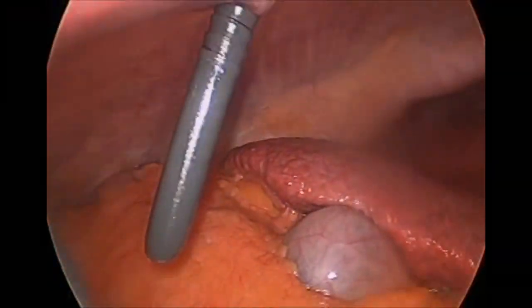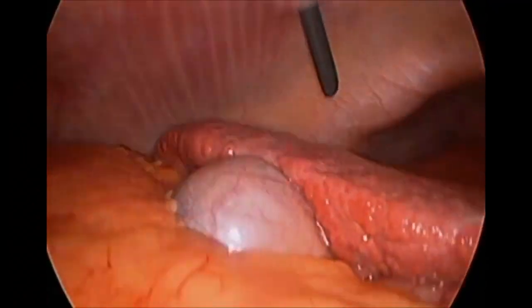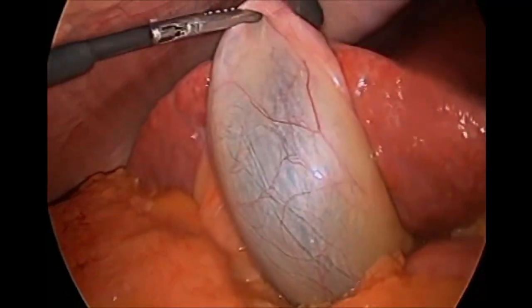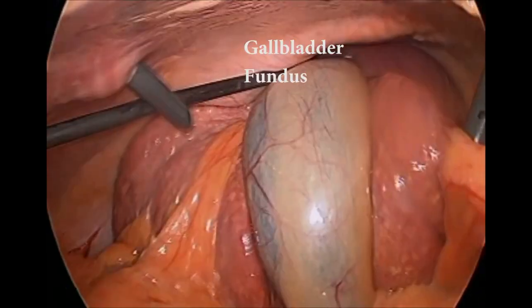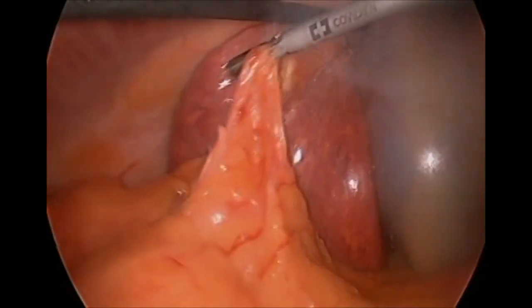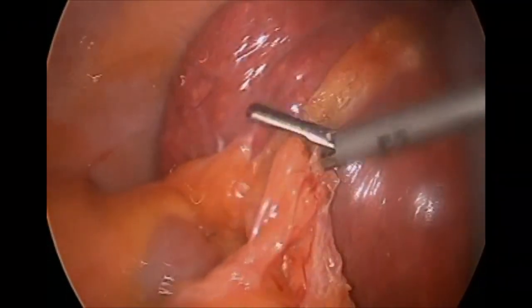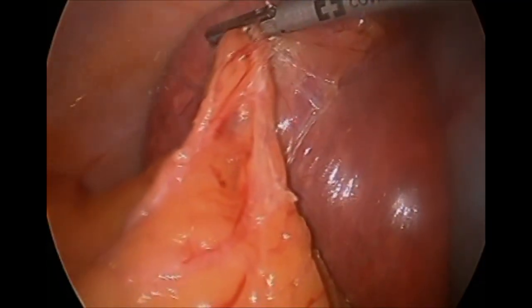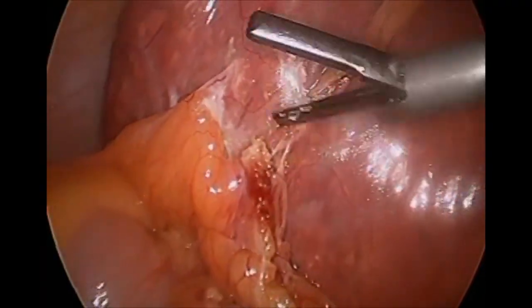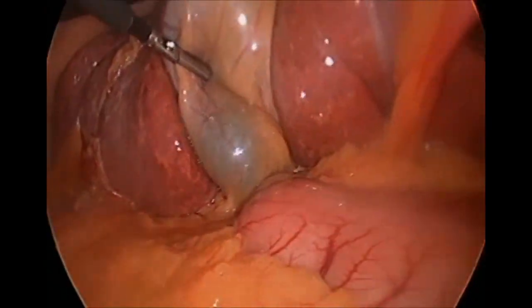Now we place three trocars in the right upper quadrant area of the abdomen. Then we will retract the gallbladder towards the patient's right shoulder. Now we are dividing some of the inflammatory adhesions between the right colon, the greater omentum, and the undersurface of the right lobe of the liver using the Sonicision ultrasonic dissecting device.